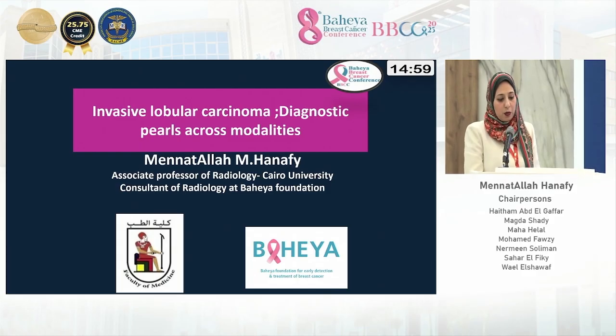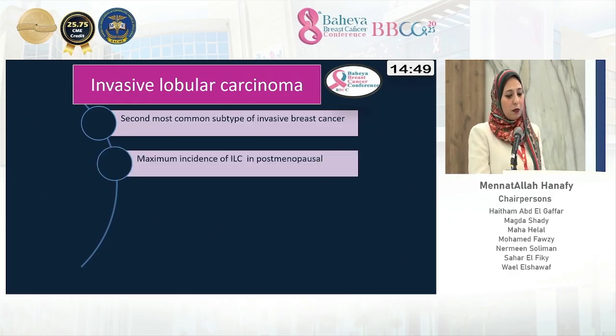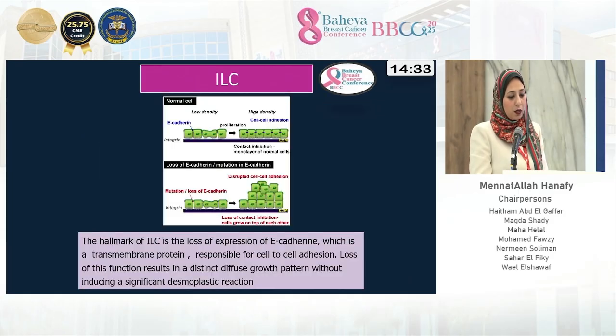Invasive lobular carcinoma, diagnostic pearls across modalities. Invasive lobular carcinoma is the second most common subtype of invasive breast cancer, with maximum incidence in postmenopausal women and a higher incidence of multiplicity, multicentricity, multifocality, and contralateral disease. The reported sensitivity of mammography for detection of invasive lobular carcinoma ranges from 57% to 81%.